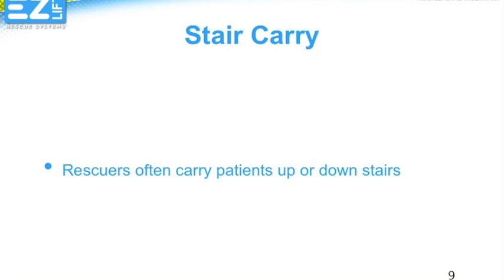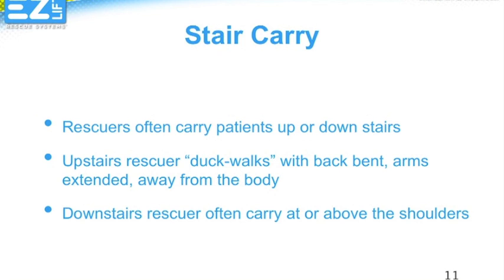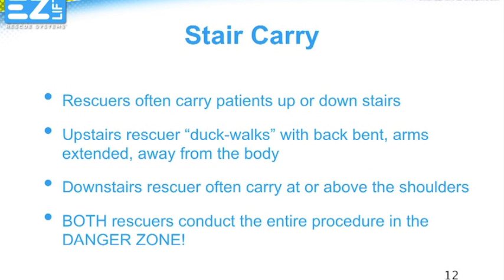We all know you can't always get the gurney as close to your patient as you'd like. In those cases where you have to carry a patient up or down stairs, the upstairs rescuer has to duck walk, bending at the waist. The downstairs rescuer often holds the patient high to keep them level. Both rescuers are in the most dangerous zone for injury.